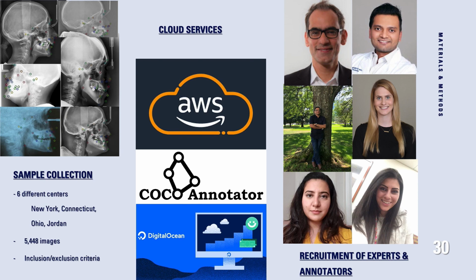The computational power necessary to run the model exceeds the abilities of most personal computers. Additional graphic processing units were purchased from Amazon Web Services to accommodate this demand. DigitalOcean was used to provide the hosting service for the COCO annotator application, storing the image data and the data of the landmark points. 2 individual humans served as the human experts for determining the gold standard of human error. You may recognize them. They also calibrated the other orthodontists who assisted with algorithm training through landmark identification.